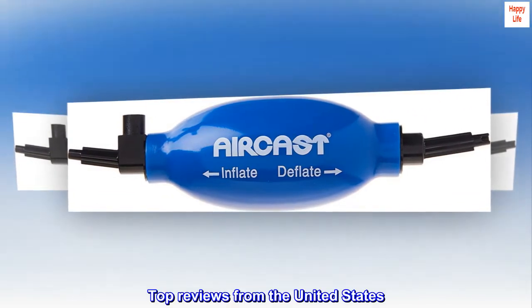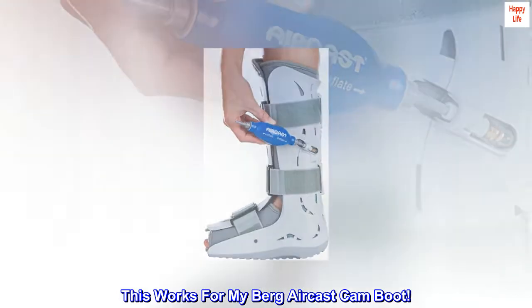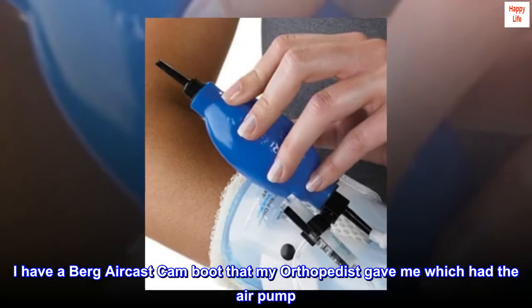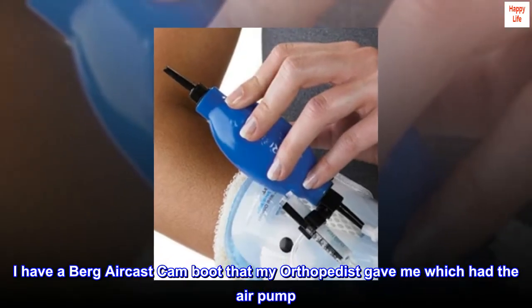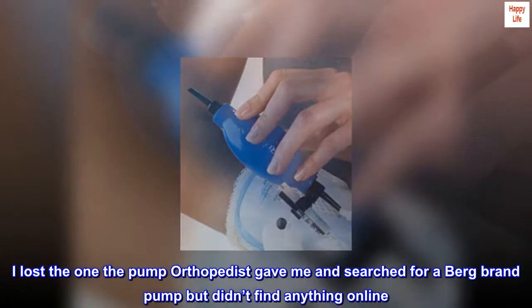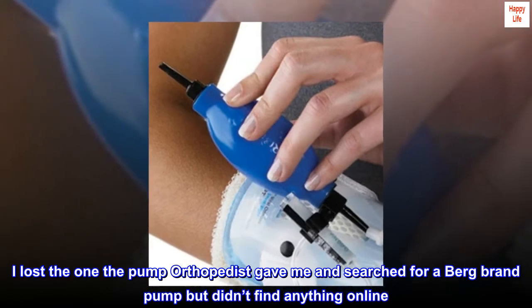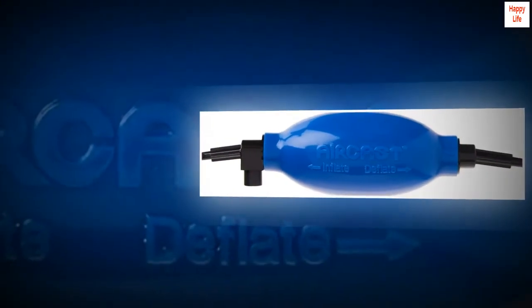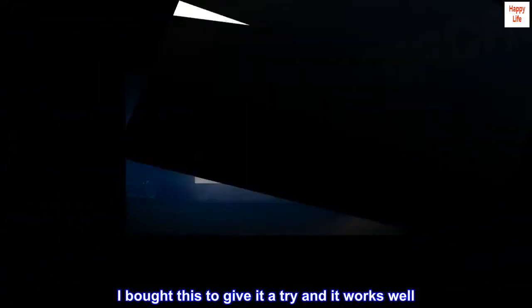Top Reviews from the United States. This works for my Berg Aircast Cam Boot. I have a Berg Aircast Cam Boot that my orthopedist gave me, which had the air pump. I lost the pump my orthopedist gave me and searched for a Berg brand pump but didn't find anything online. I bought this to give it a try and it works well.